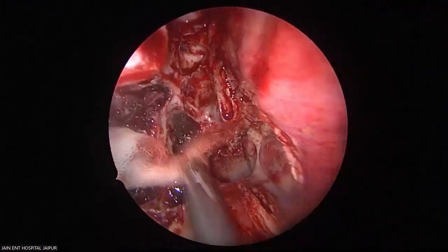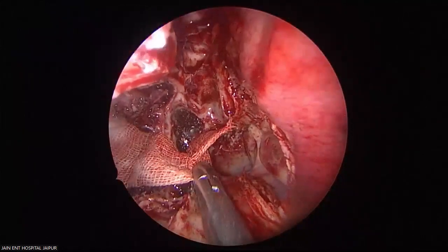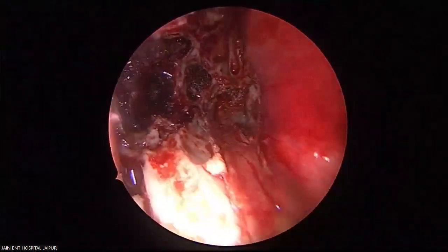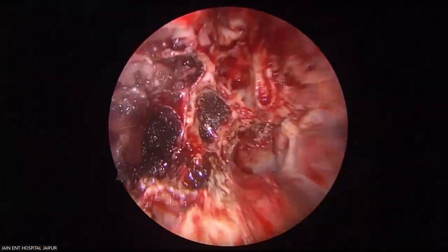Any bleeder you can look. Any doubts? But we will still pack for a day or two, and then we'll advise this patient. That's it. That's the final picture.